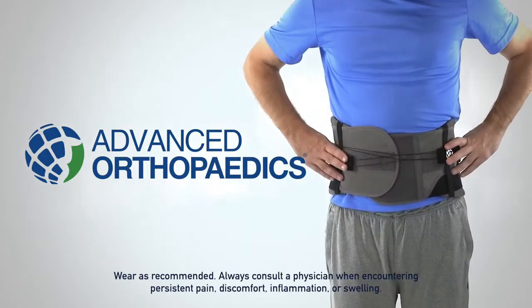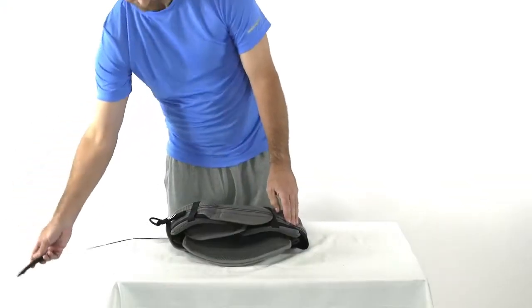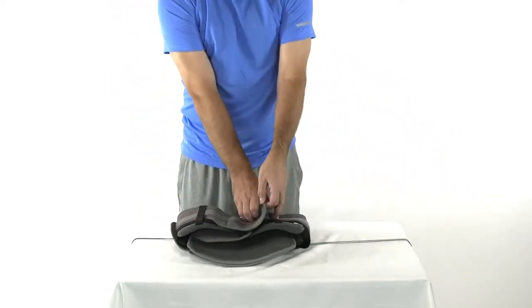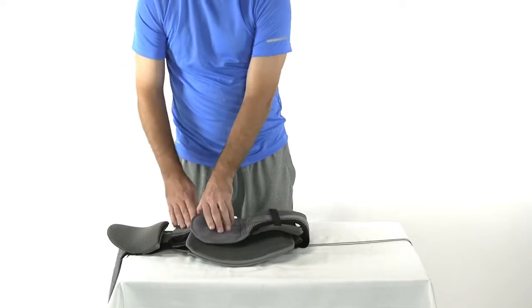The lightweight and universally sized concert adjustable LSO from Advanced Orthopedics provides needed circumferential compression to increase trunk stability and relieve targeted pain.